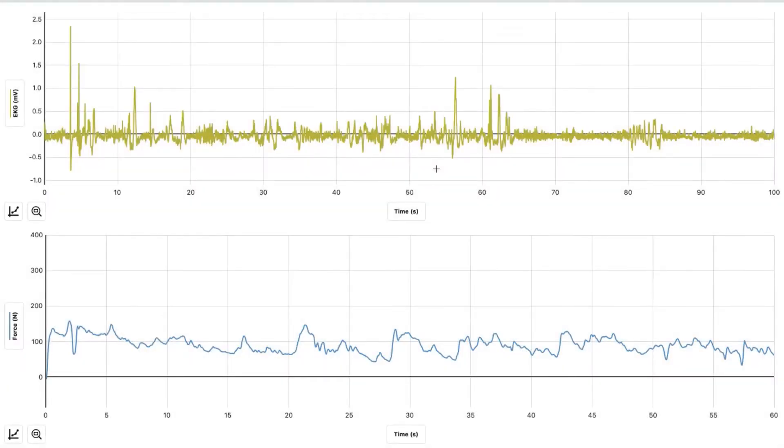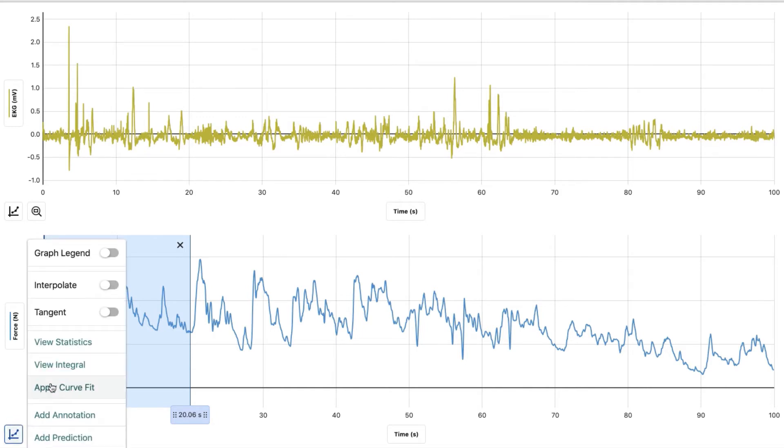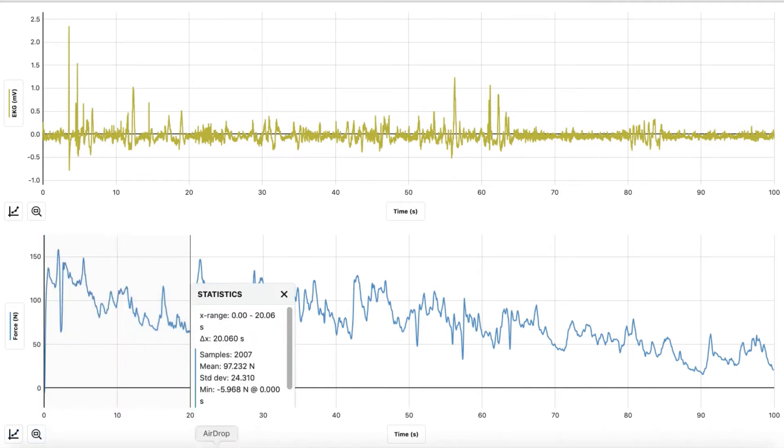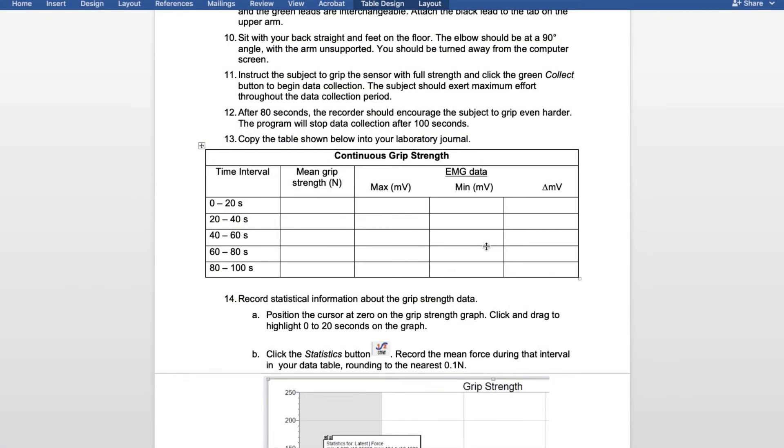Now we are going to read the data for variable 1 visual feedback. The first thing we're going to do is read the force. Find the end line, then hold down and select from 0 to 20 seconds. Hit the graph, view statistics, and it gives you the mean. For the mean grip strength from 0 to 20 seconds, we got 97.2. Remember, we're rounding to the closest 0.1.